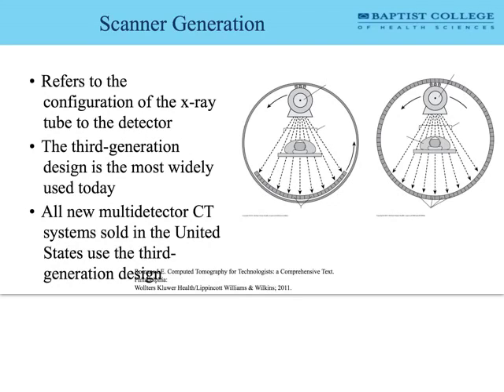And the big thing that is helpful, I want to point out, in terms of technology, I think we've all got that the slip rings are awesome, fan beam is awesome, those things are good. I want to point out one little tiny thing here at the top of page 19 about this detector spacing and aperture, right? This is something that we could easily gloss over, but it's equally awesome. It's just as awesome as the slip rings and the fan beams and all that kind of stuff.